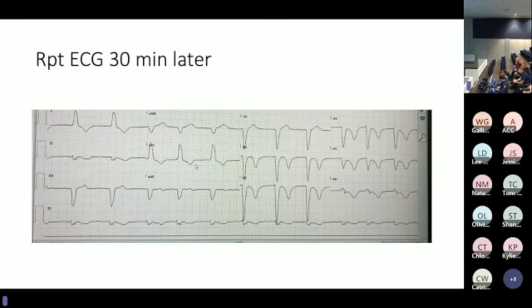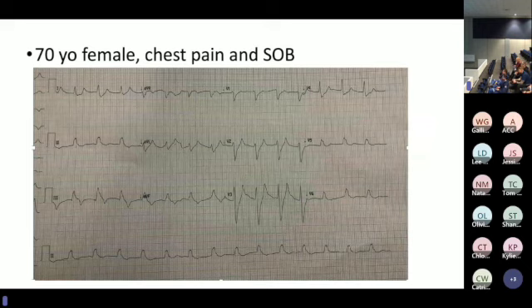This patient was in cardiogenic shock with APO at the time they presented. It was nighttime at Canterbury Hospital, with a bit of difficulty convincing the cardiology registrar on the end of the phone to take this patient, and they ended up staying in Canterbury till the morning, with an echo that showed apical hypokinesis and a fairly normal cath. So that was, I guess, a STEMI mimic, but still would be considered criteria for considering reperfusion. Okay, next one.